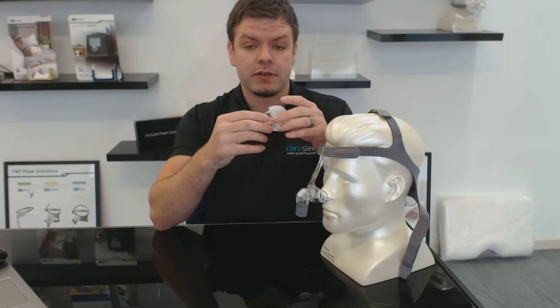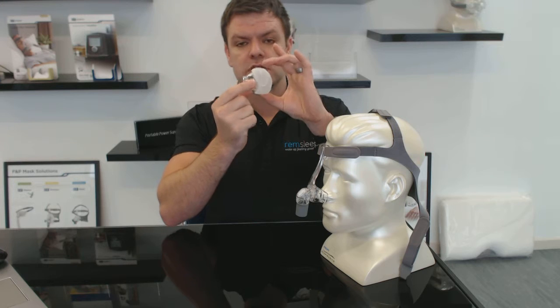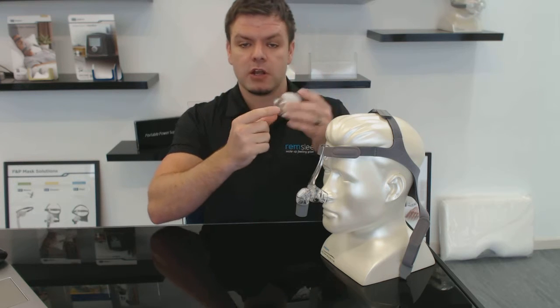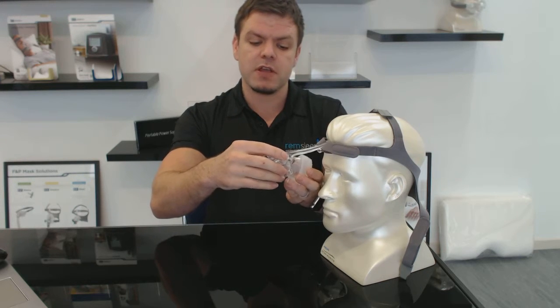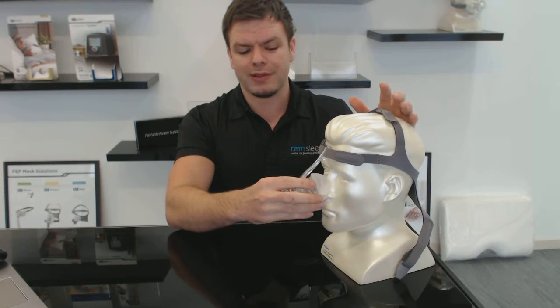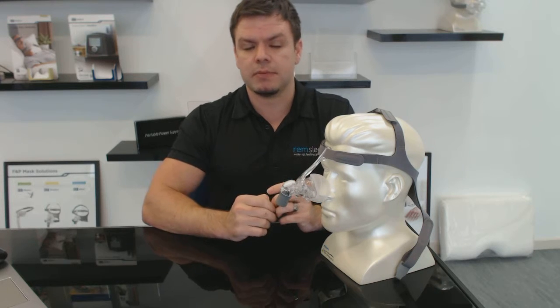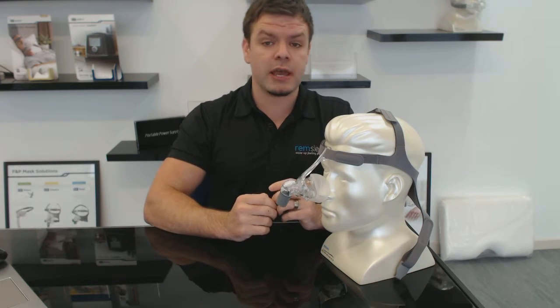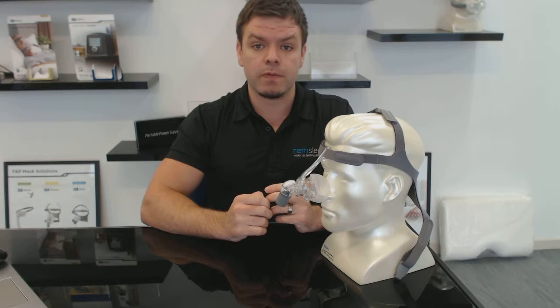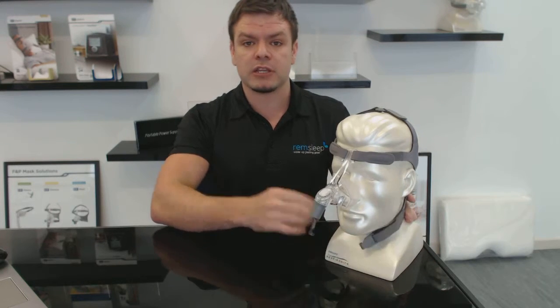Another good thing is that if you need to change size, the different size cushions — small, medium, and large — all fit onto the same frame. It's very easy to just click one off and click another on. You can download a sizing guide from the Fisher & Paykel website and cut it out to check which size is suitable for you.